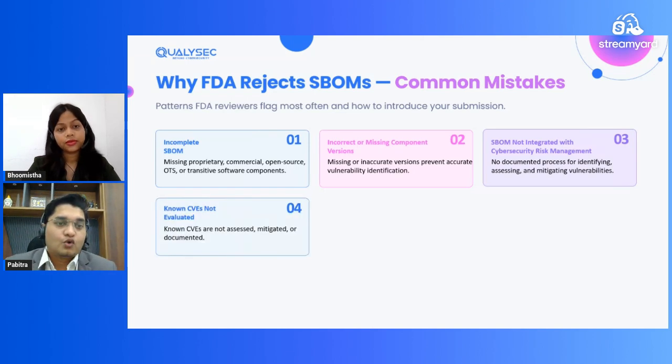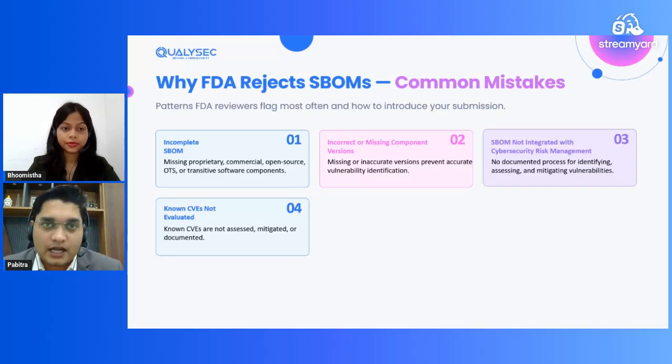Fourth point, known CVEs not evaluated. See, finding the component name, having the version, and having their CVEs is only half done. You also have to evaluate whether this CVE is actually affecting my device, and whether this CVE is actually creating any impact on patient data. Those things you have to evaluate and mitigate.